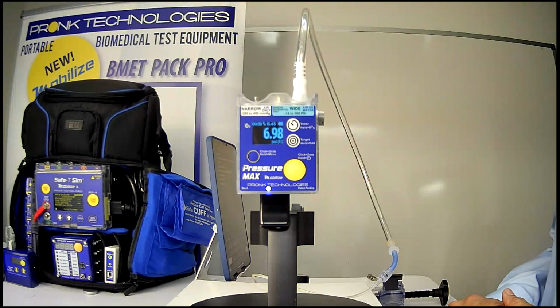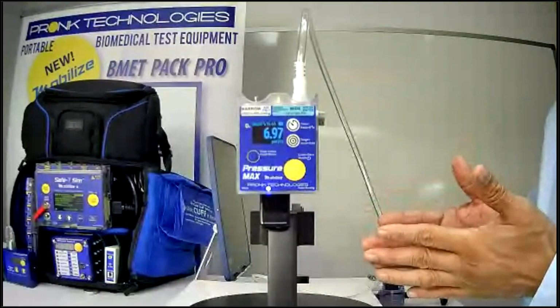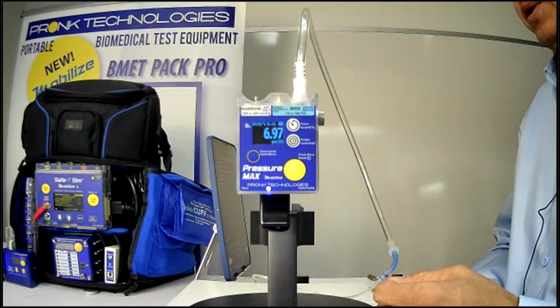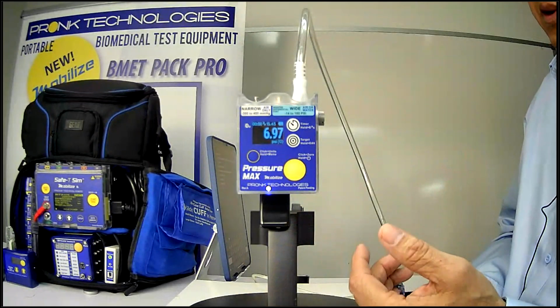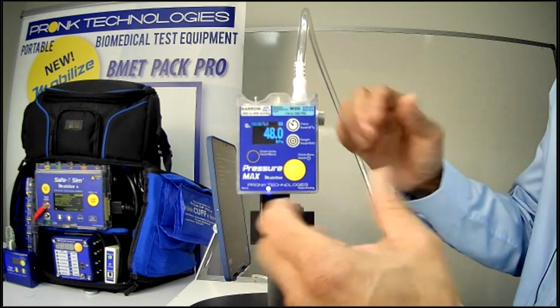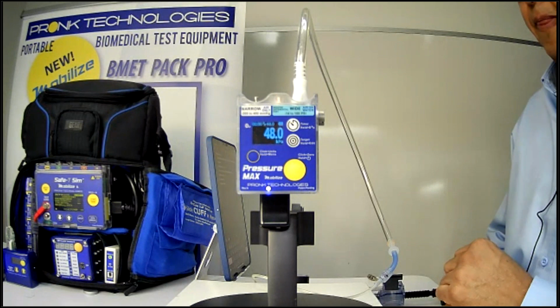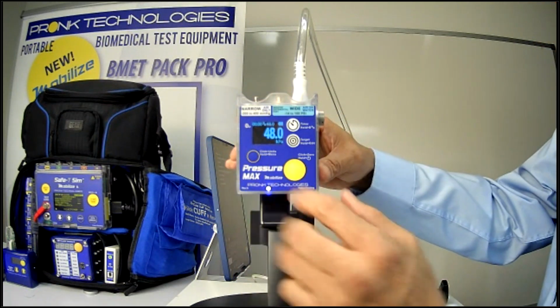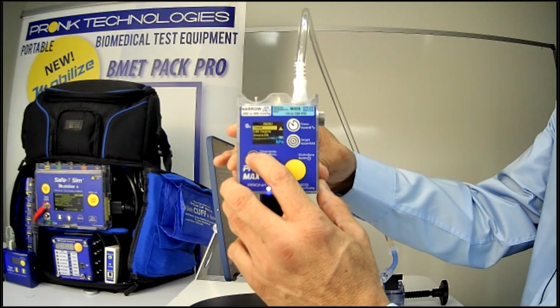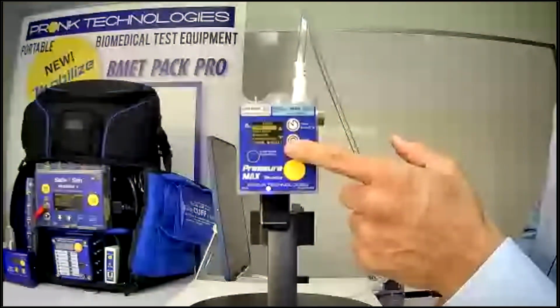The other thing that's helpful is oftentimes with pressure meters, you need to be able to utilize it for the units of measure you test with. And maybe you don't necessarily need to have 11 different units to measure. You're only really utilizing 2. So instead of having to scroll through the different units of measure, you can save time by just programming what units of measure you want to be displayed. And you can do that by going into the menu, which you can get to by hitting this button and holding it. So hitting this button and holding it will activate some features here we'll go over.